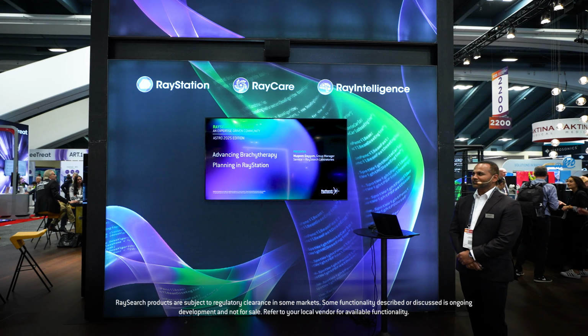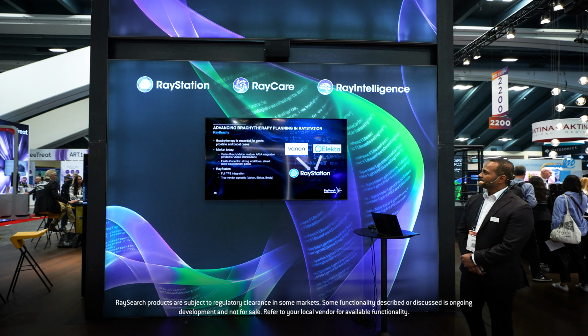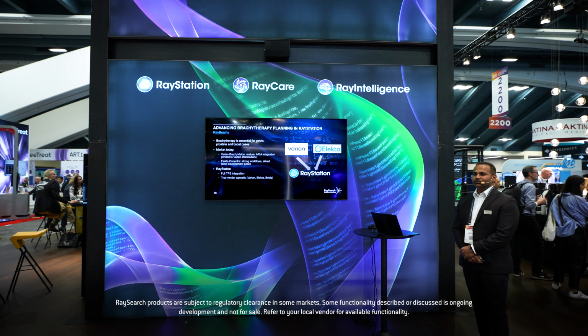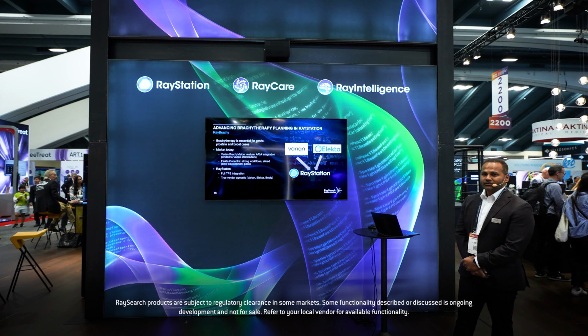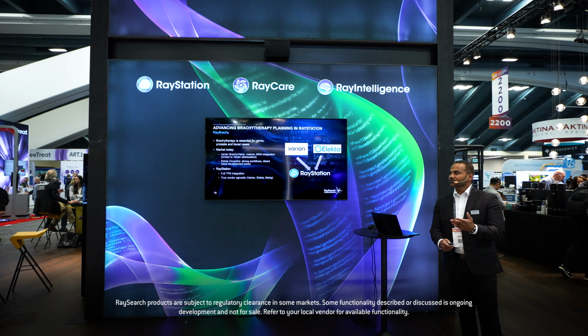All right, so we're going to talk about brachytherapy. A couple of things about advancing brachytherapy in RayStation. We have a module called RayBrachy. We know that brachytherapy, cervix, and prostate and boost cases are the important part.